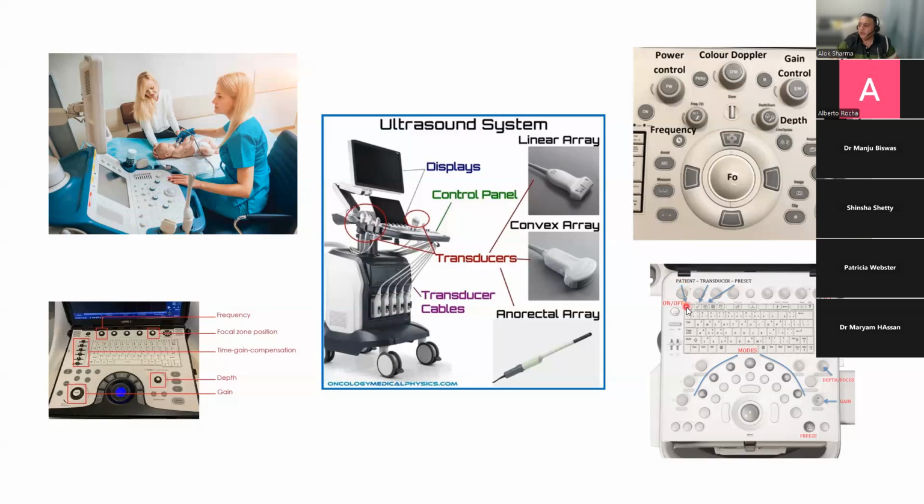They will then let you fill in patient details. Now, there might be a patient marker that allows you to do it. In our GE, actually, we have to go to the actual screen and enter the patient details by clicking on patient. Once we've entered patient details, in our setup we need to enter patient name, sex, gestation, weight, and an MRN number. Those five details give us what we need to save those patient identifiable features and images under them.